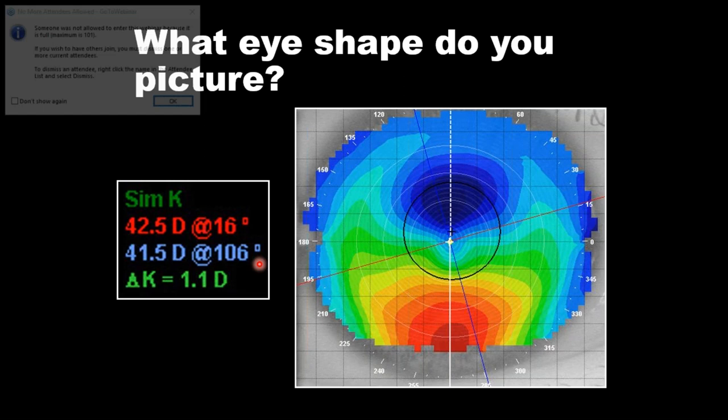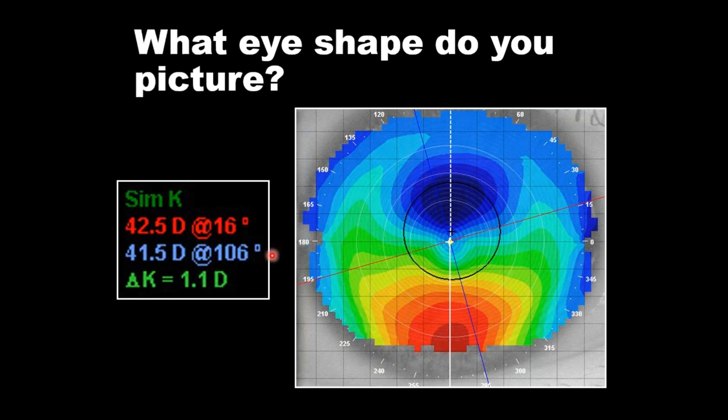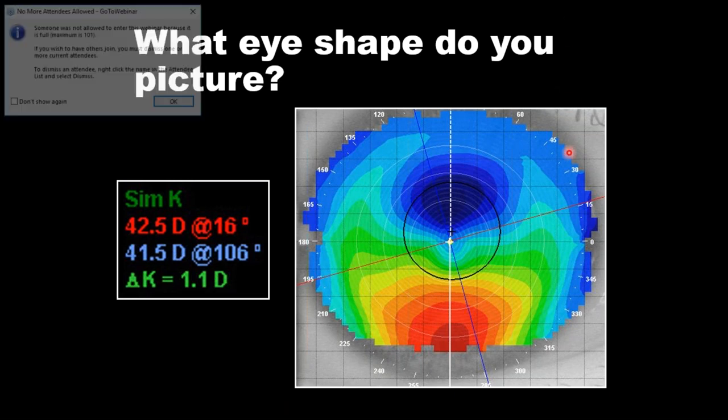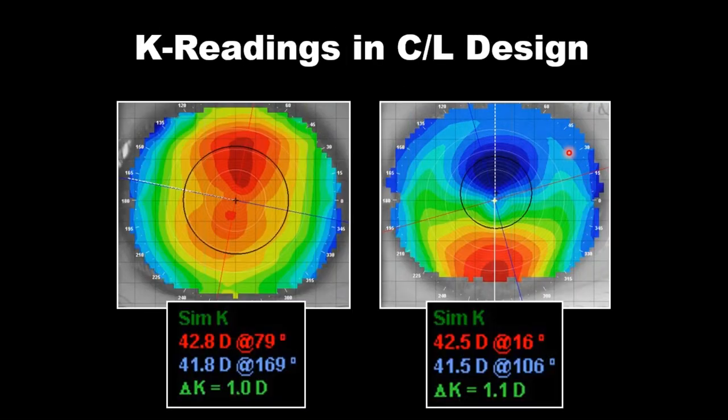K readings would do a very bad job of describing this cornea and the contact lens path we should take. Como pueden ver, esto es una córnea post-cirugía refractiva. La queratometría simulada sola, sin tener la topografía en la mano, nos juzga pobremente lo que está pasando en ese ojo. Uno no se esperaría una queratometría tan sencilla con 1.1 dioptría de una ectasia post-cirugía refractiva.